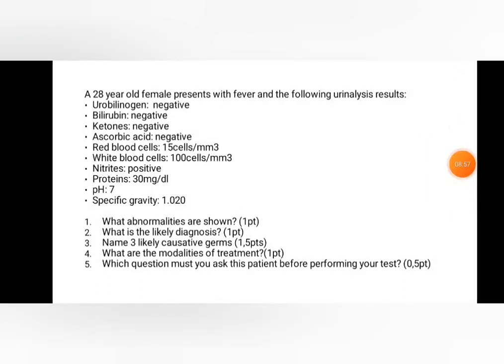Now, the next point after that, we have spoken about the white blood cells. Since the red blood cell and the white blood cell counts have been given in the question, it means that they have done a microscopy. For the red blood cell, to analyze it on the urine dipstick is hematuria. There's a portion of non-hemolyzed blood and there is hemolyzed blood. And for the white blood cell, to identify white blood cells on urine dipstick, you're going to visualize the leukocyte esterase enzyme. It's going to be 1+, 2+, or 3+ and so on.